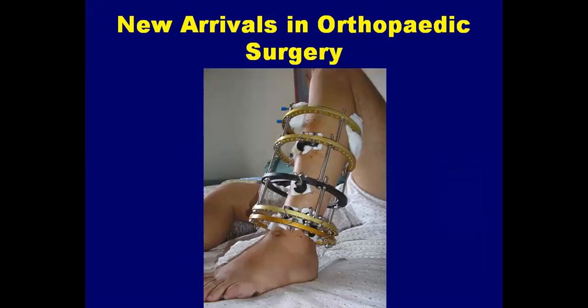If we look back, see the evolution of Ilizarov, there was a time when each and every fracture was being fixed, tried to be fixed with the help of Ilizarov. Let it be mandible fracture, let it be clavicle, let it be spine fractures, even flat bone fractures. Everywhere there was boom of Ilizarov, but finally the gap non-union, infected non-union, and open fractures are the absolute indication for these Ilizarov fixators.